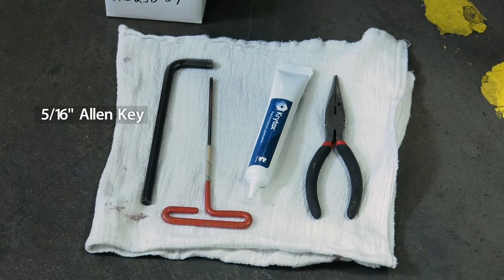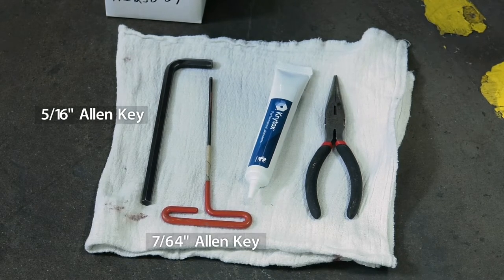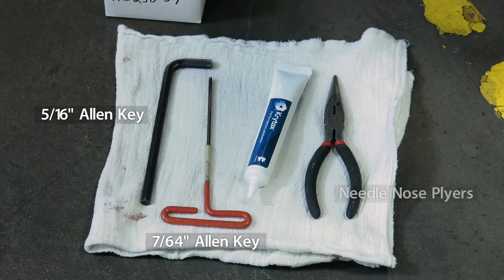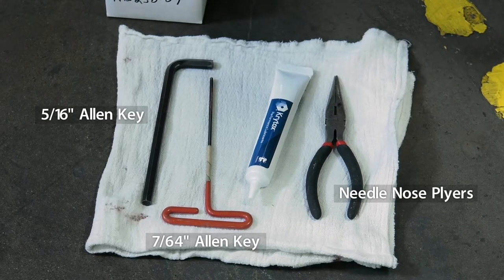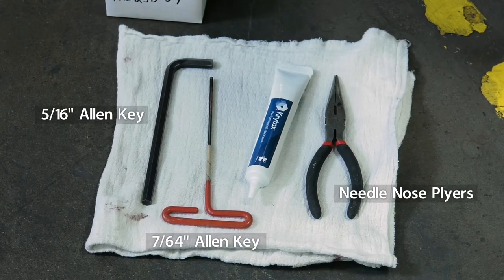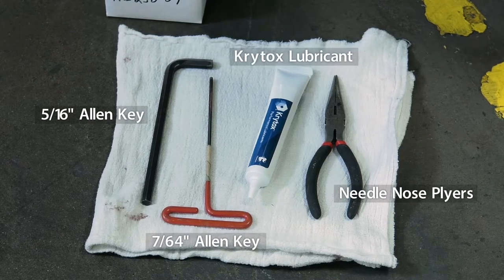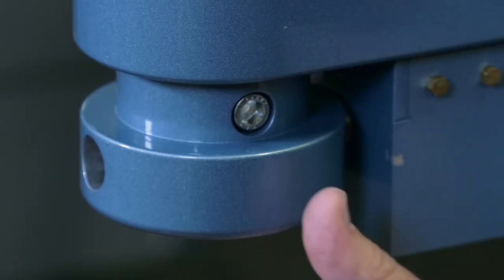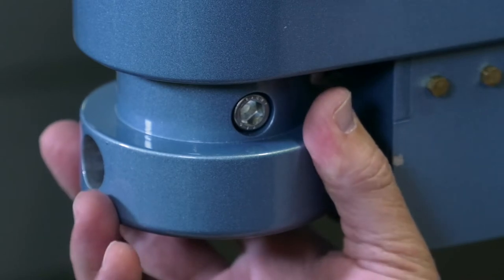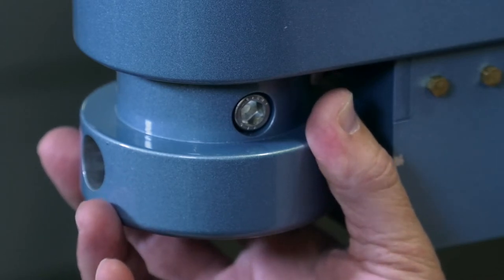We have the 5/16ths Allen key, we have the 7/64ths Allen key, we have a needle-nose pliers just in case we need to pull the three-way valve out, and then also the Krytox to lube the O-rings.